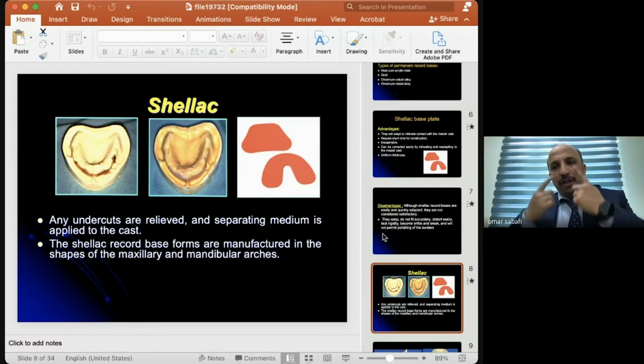Finally, when you are arranging the teeth, you have problems in these arrangements because you put the two central incisors in the midline, and you have the frenum attachment located on one of the sides. Look, now you have a problem. The denture area in the middle is not in the middle of the teeth. So the shape of the denture is destroyed, and the location of the two central incisors is destroyed.